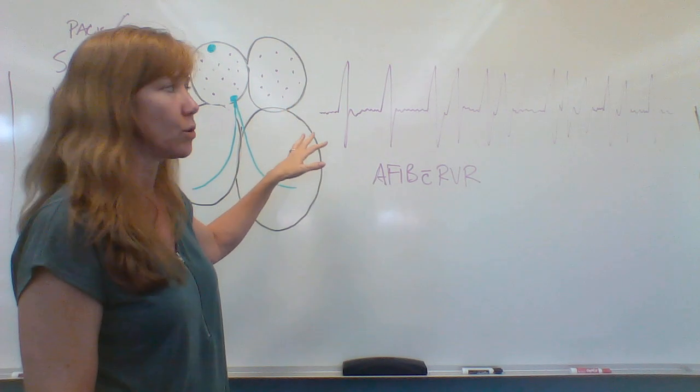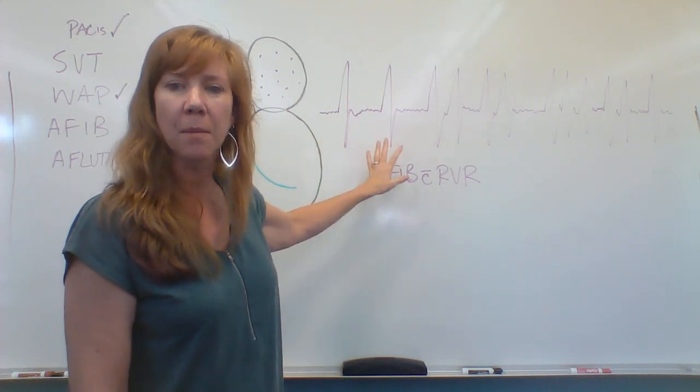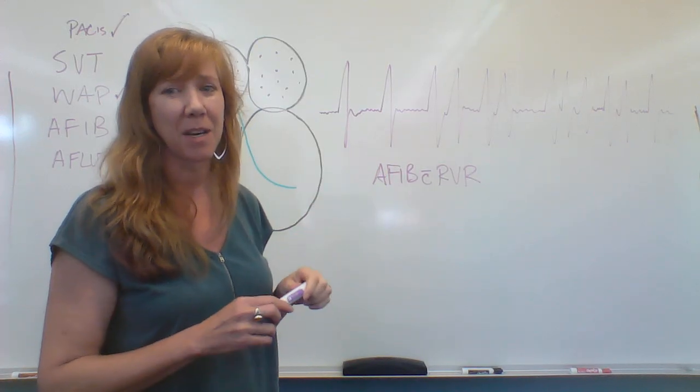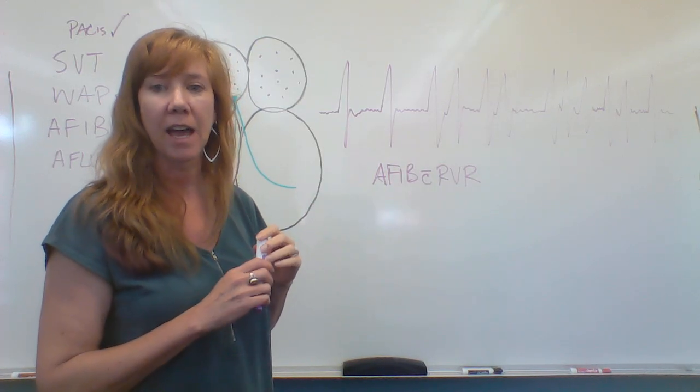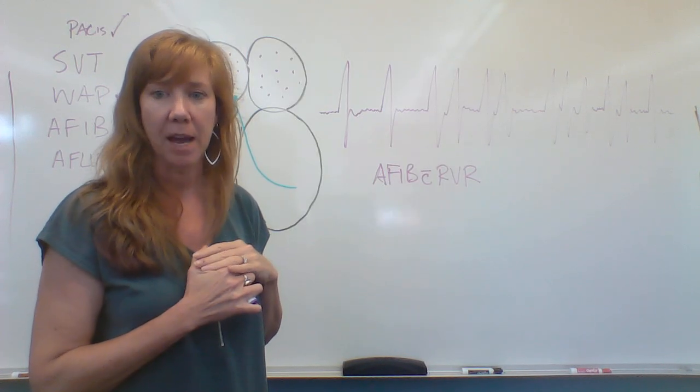It's more usual to have high heart rates in AFib, and people sometimes do have sinusy heart rates in AFib, but it is common to have high heart rates in AFib. AFib with a rapid ventricular response. And then those people can be very symptomatic.